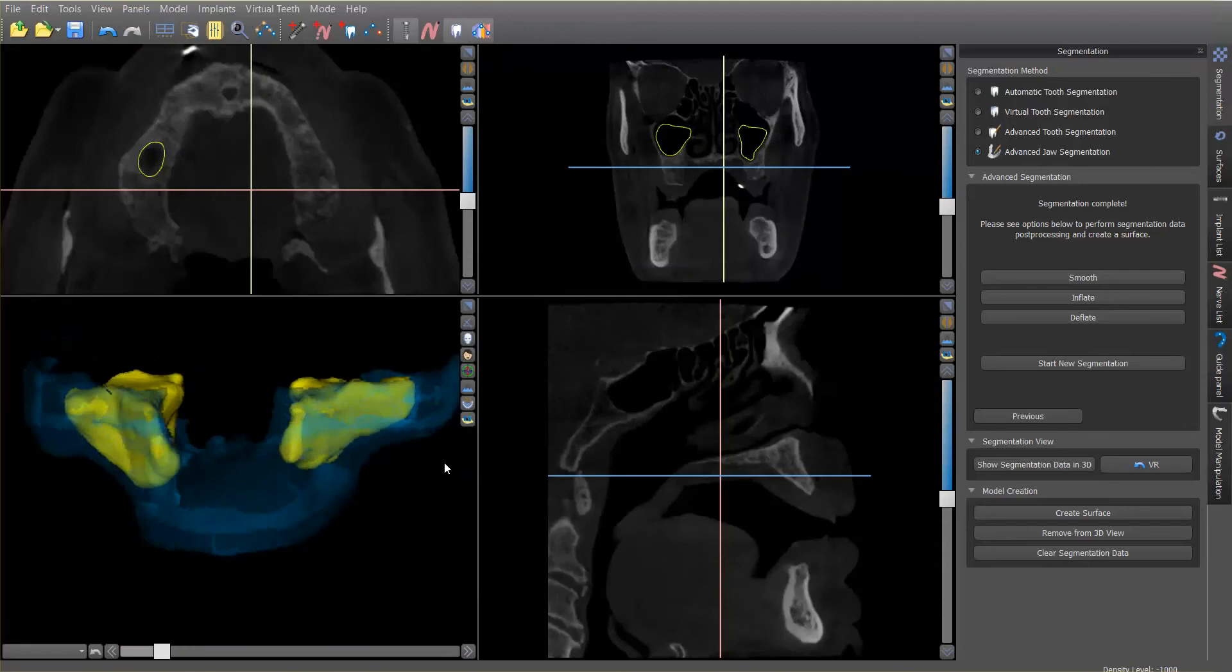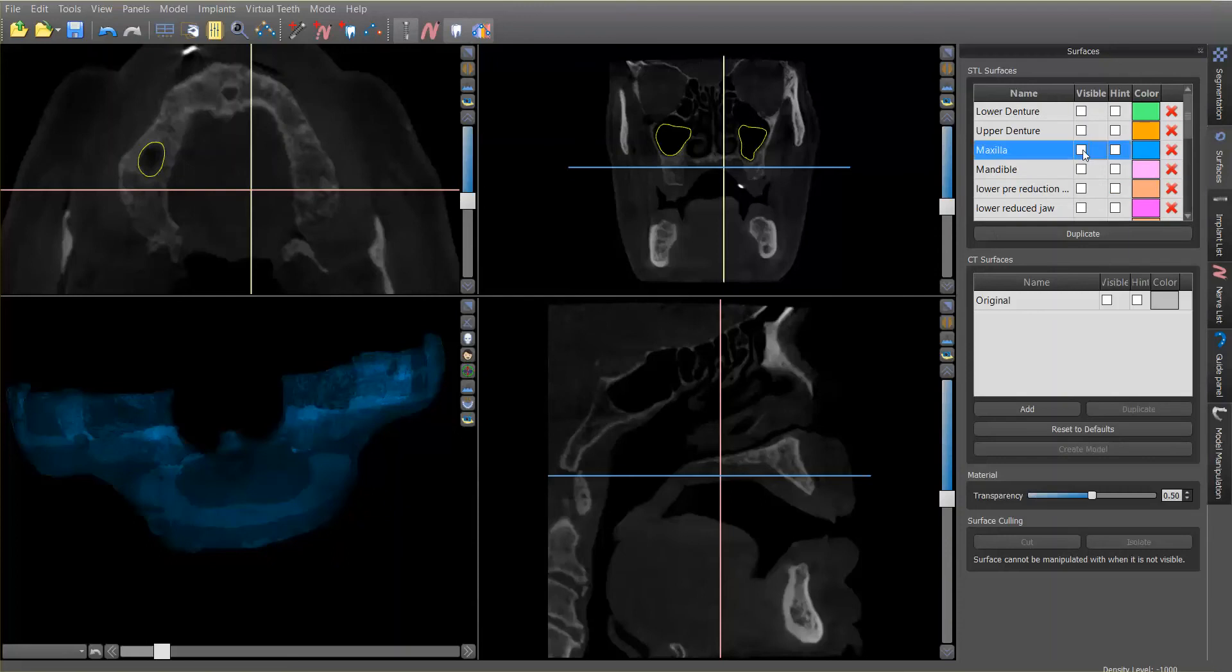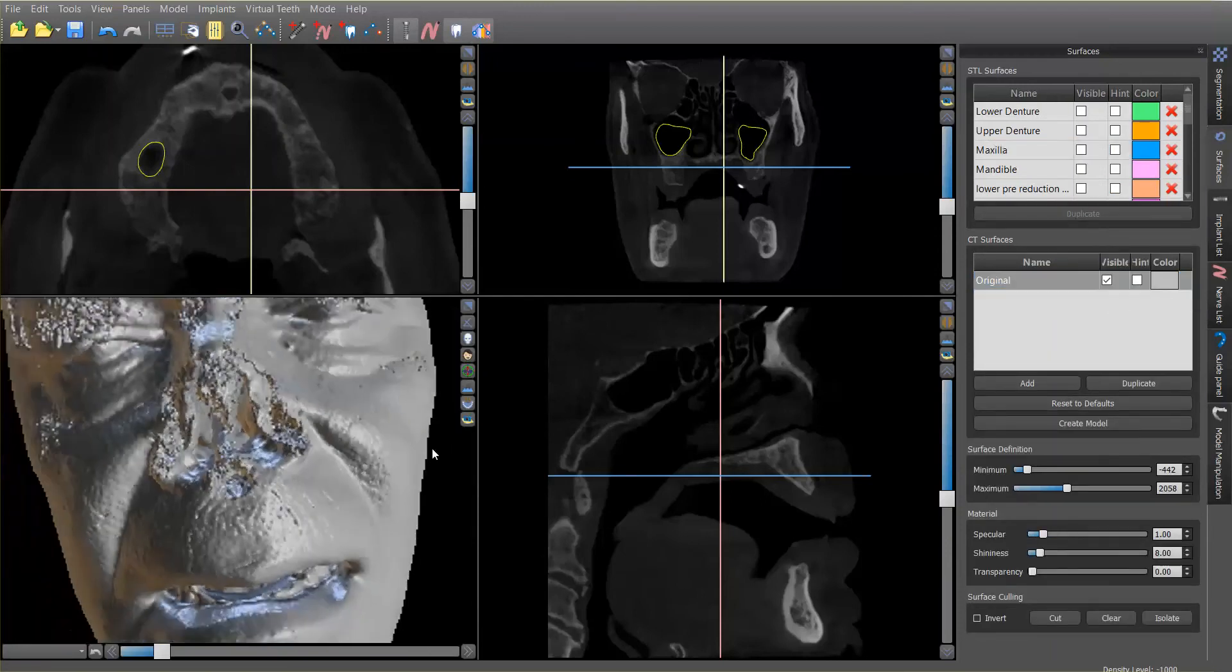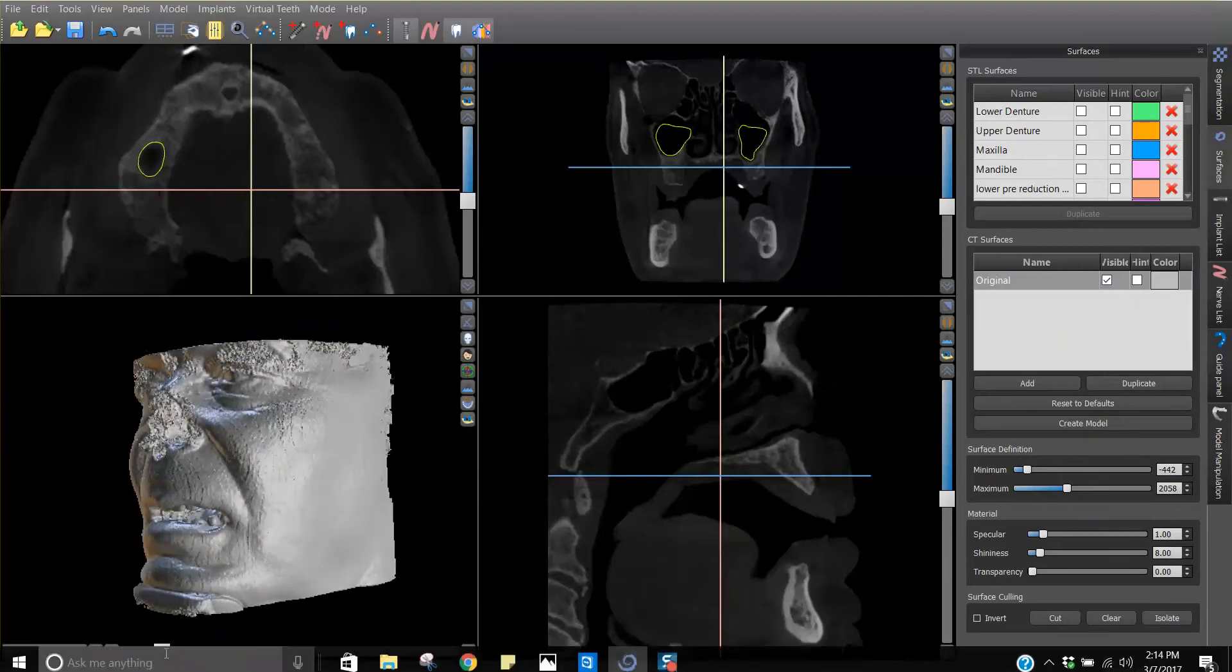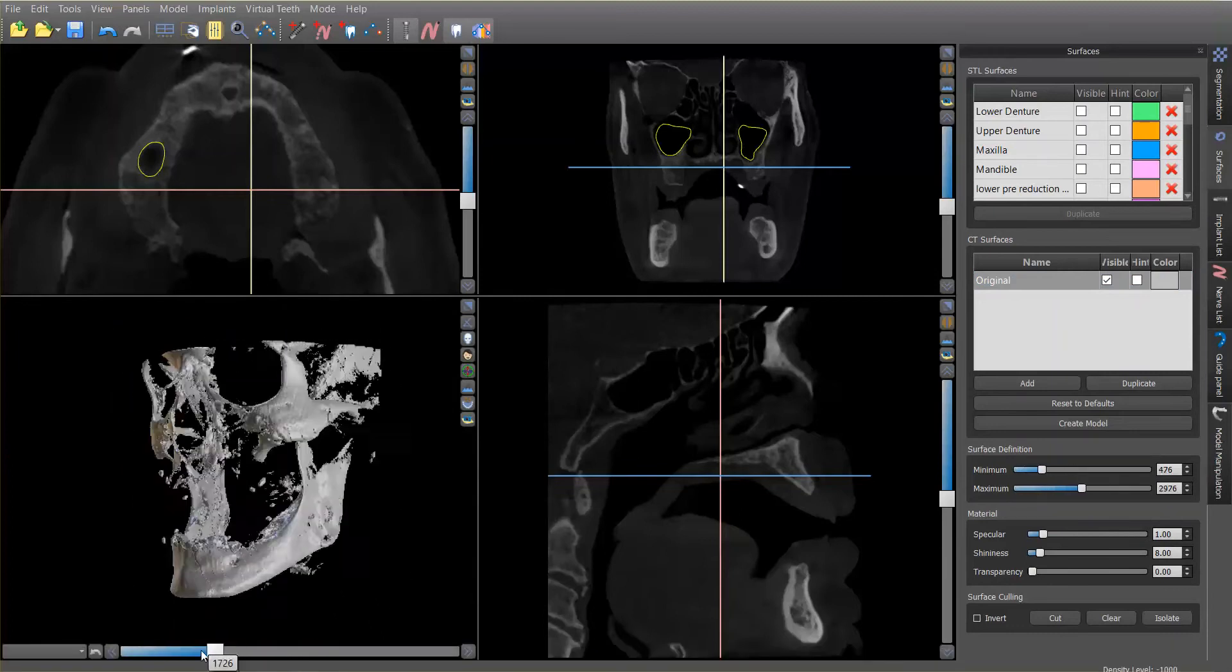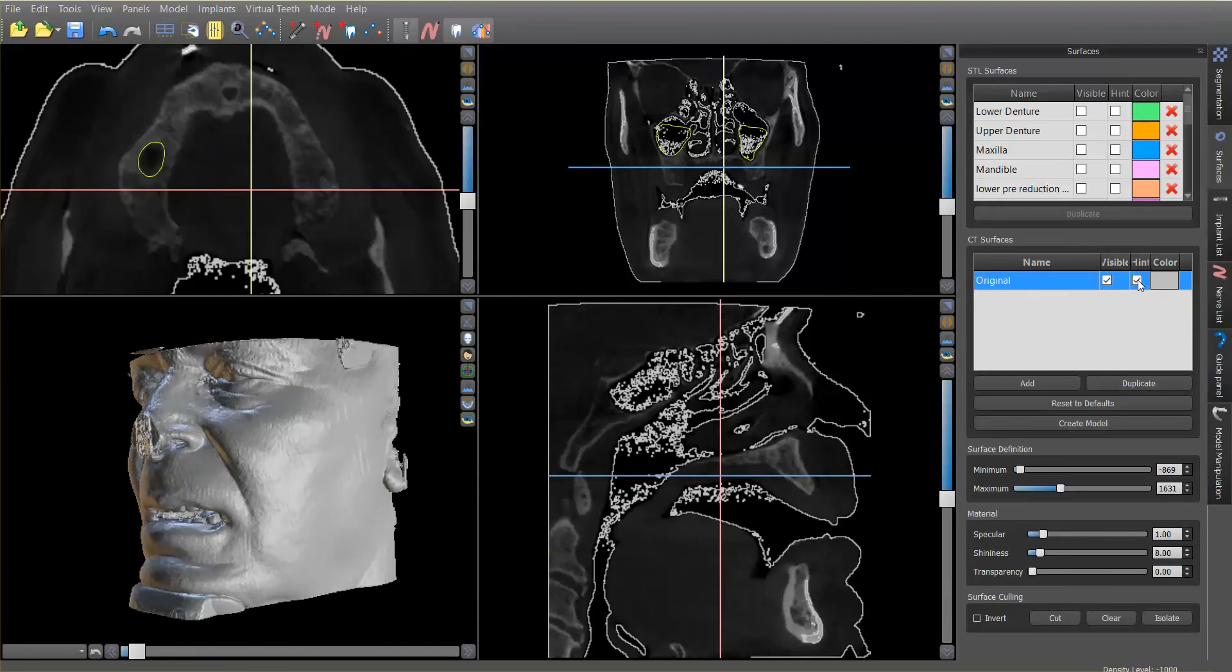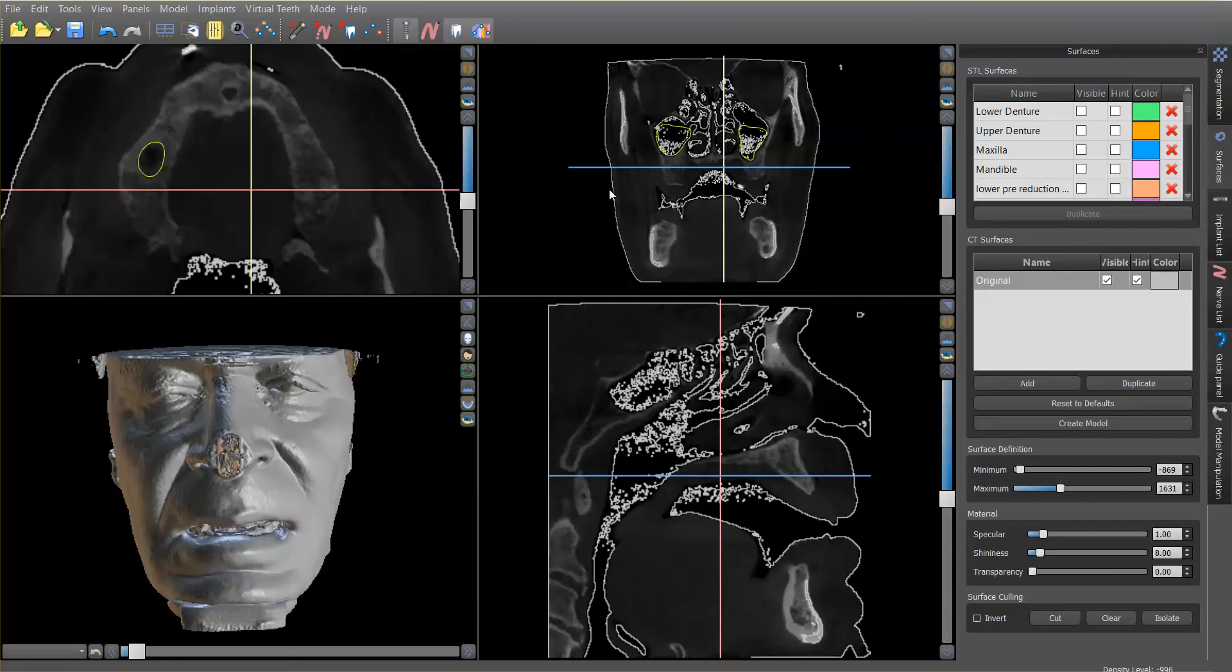So from there, I started trying to play with another option. Let me turn that model off and let's turn back on this original rendering. So you know when you've got your 3D rendering, you've got the ability to use the slider down here to adjust the density up and down to different things. Now, something else that we have is this little checkmark that we can click on the hint, and if we turn on the hint, that is going to show us basically the STL outline.